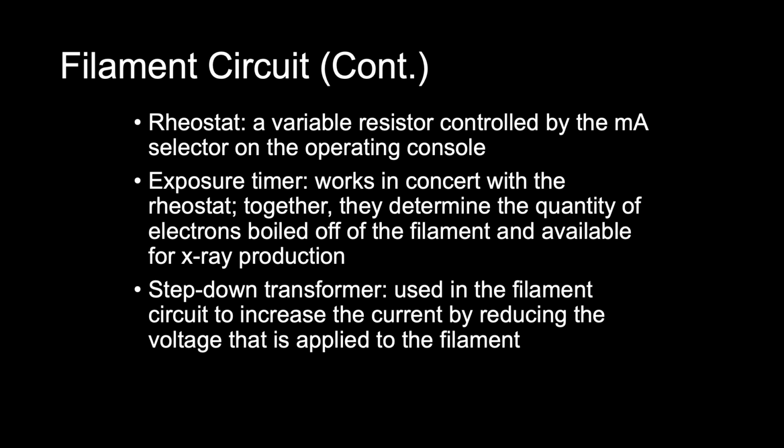So you should note that the exposure timer works in concert with the rheostat. The rheostat controls filament temperature and the rate at which electrons are boiled off the filament. The timer determines the duration of the process, and together they determine the quantity of electrons boiled off of the filament and available for X-ray production.